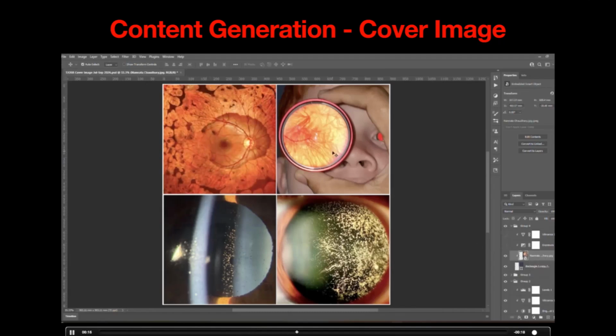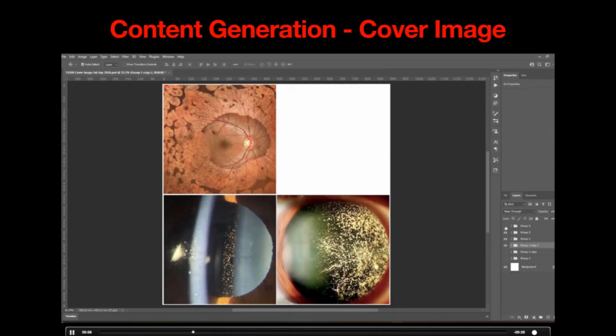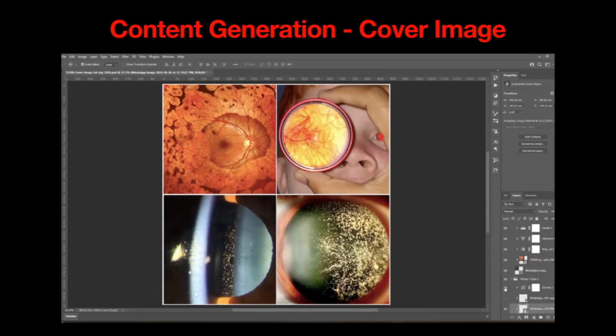So you can see that when you see it in a videographical way, you can appreciate the small differences that the image undergoes to finally become what it finally becomes. You can see the small amount of course correction that is being done. I'm just going back a bit. So this is how it is. I'm just forwarding it quickly for your brain to pick up the small correction that is being done, right? So that actually gives you the final crispness or the final endpoint.